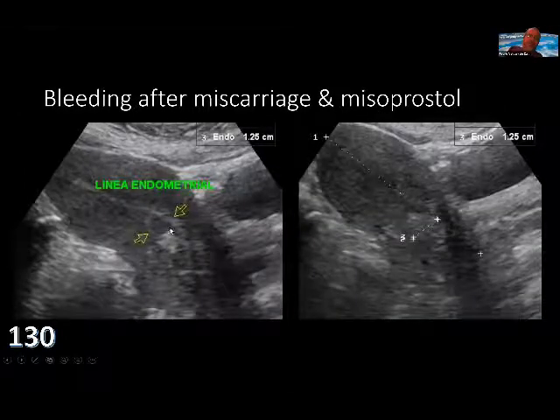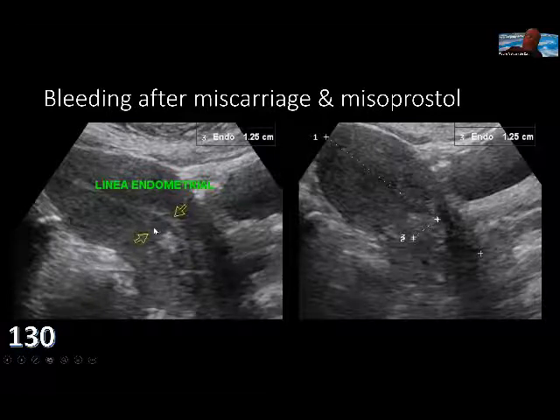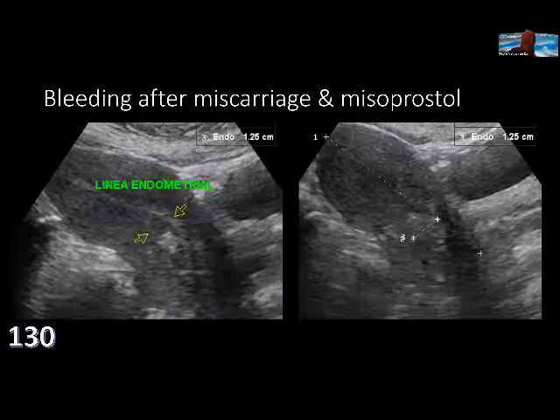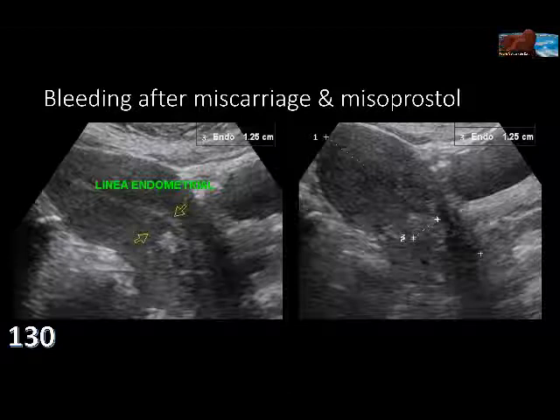And sometimes after taking misoprostol, there are some things that have not come outside yet, and she had an abnormal prolonged bleeding with something in the uterine isthmus right behind the internal orifice. Sometimes the cervix gets closed and tight, and then the bleeding or whatever you have inside keeps inside.